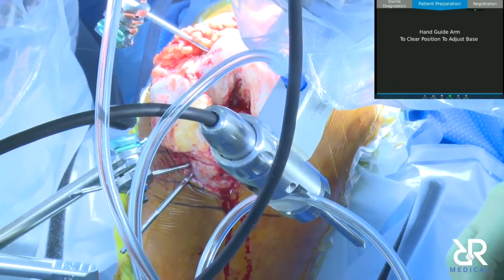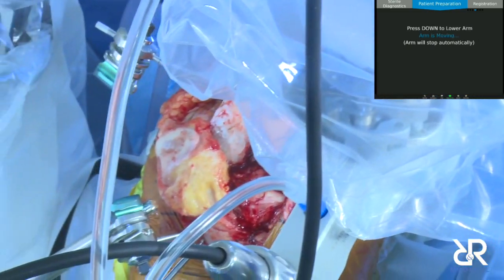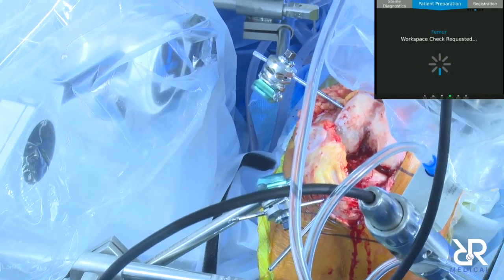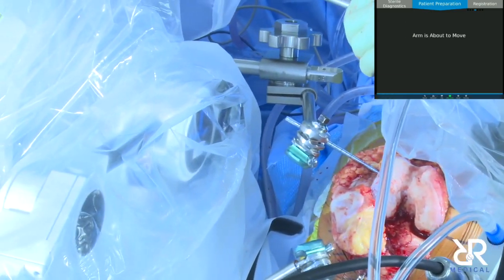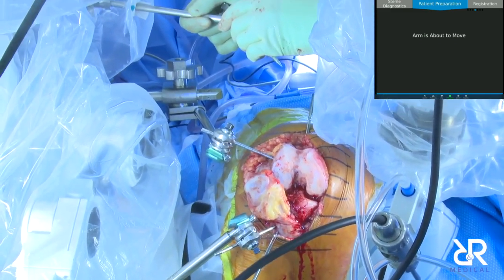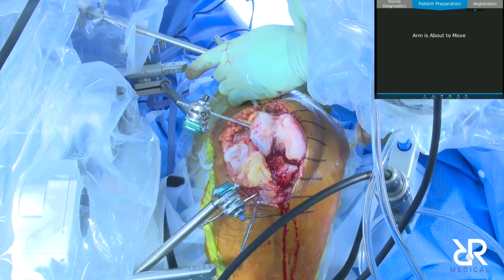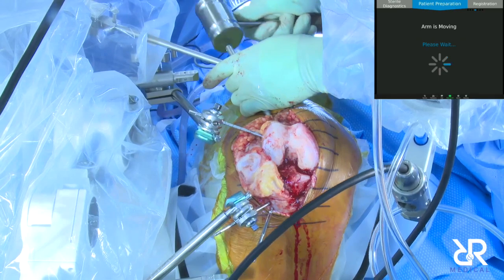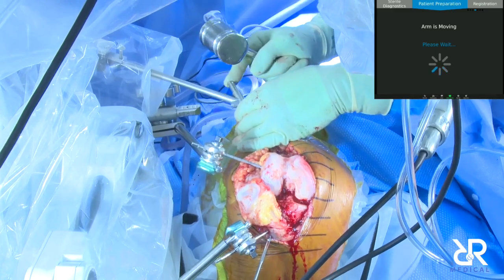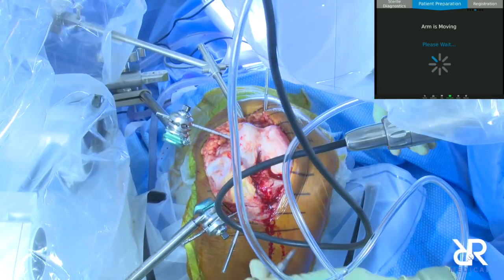Then the next step is you got to put in the motion sensor, since this does not use navigation. Like the Mako, you have optical trackers that you utilize to detect motion, and the Mako follows the knee. Well, this does not have any optical tracking, so you have to have some way to make sure that the knee does not move while you're prepping, and that's what these are. So they sense motion.